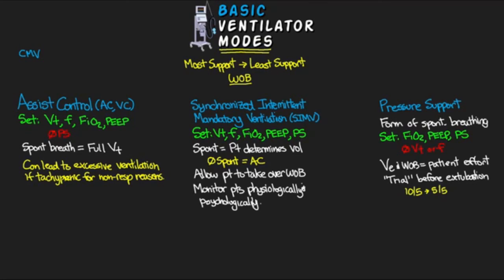to pressure support, where the patient's not going to get any mandatory breaths and everything's going to be based on their own work of breathing. Like I said, it's sort of this progression from the most amount of support and the most effort and the most coverage taking over of our patient's work of breathing down to the least amount.